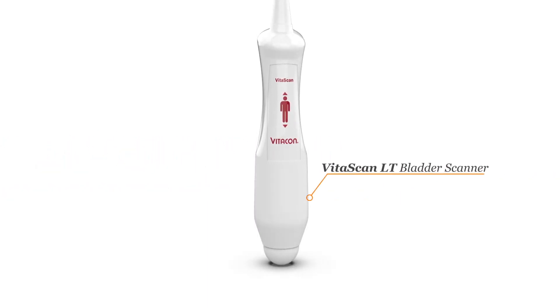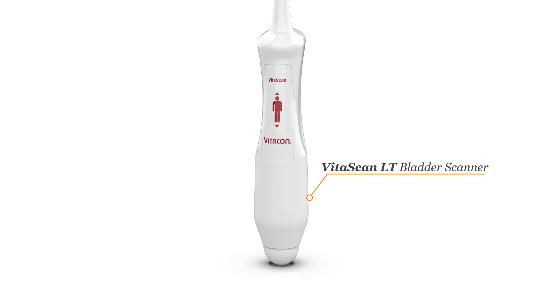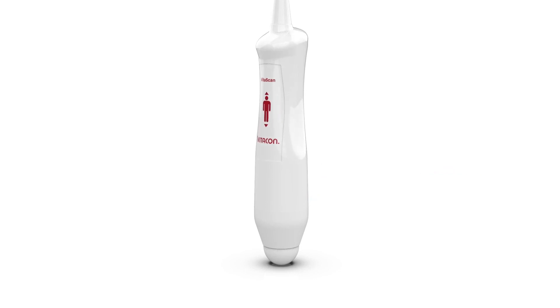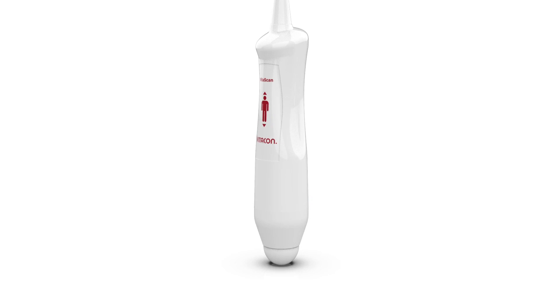Introducing VitaScan LT Bladder Scanner. Guidelines and assistance on how to perform a successful bladder volume measurement.